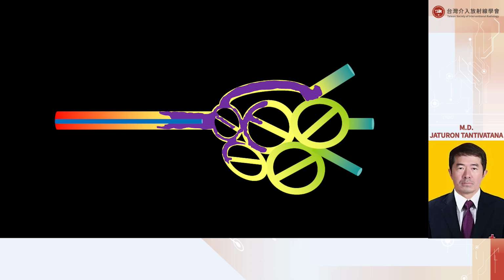So in this way, we can approximately predict how the Onyx will penetrate into the nidus, into which components or which compartment first. So it is quite important that we analyze the angioarchitecture inside the lesion carefully, so we can control the injection the way we want.